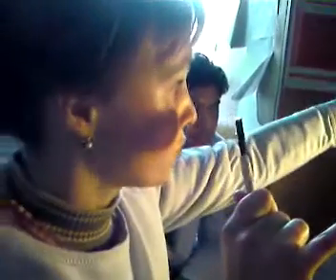So to see the optic nerve head, you will ask your patient: if you are looking at the right eye, ask the patient to look at your small finger. If you see the left eye, you will ask your patient to look at your left ear. This is to bring the optic nerve into a central position.